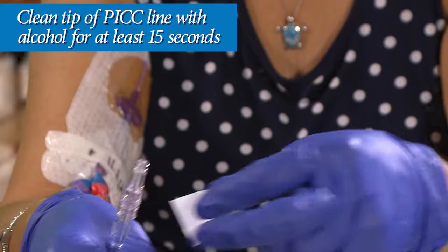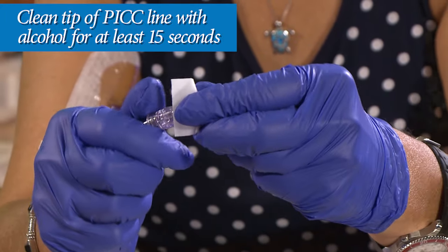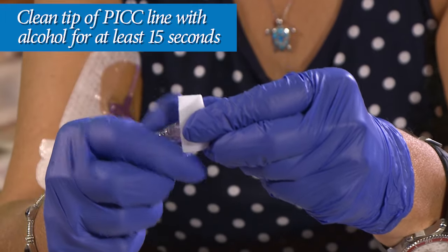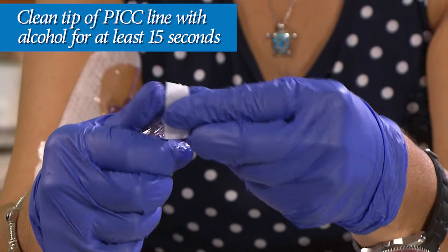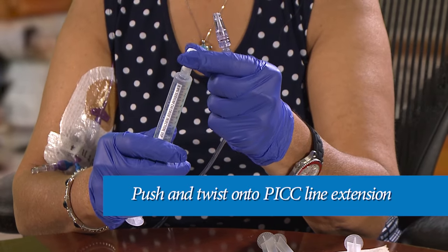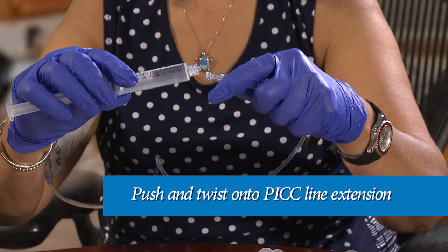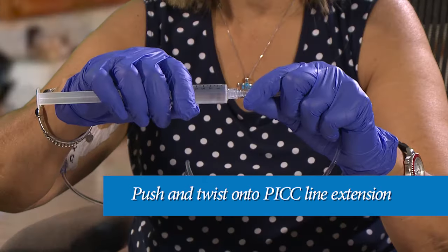Take the end of your PICC line extension and clean it with alcohol for at least 15 seconds. Always be careful not to touch the end of your PICC line extension or the tips of any of the syringes. Now push and twist a saline flush onto your PICC line extension until it is tight. Do not let it go until it feels tight.